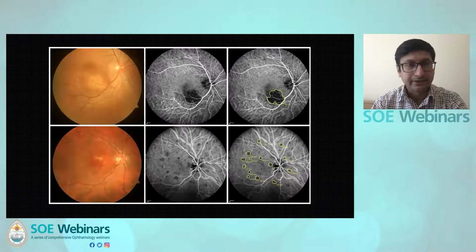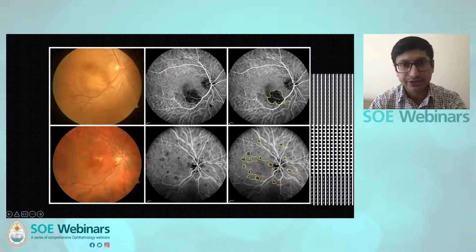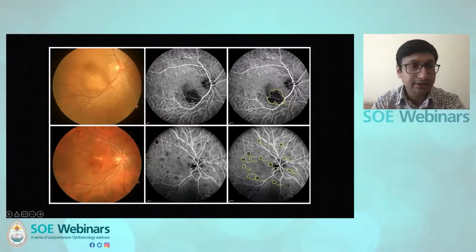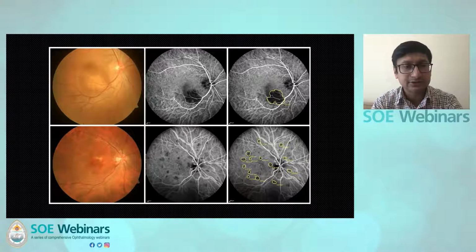Also, you see the panel above, this yellow lesion, like I showed you in a previous patient. This is another patient who has subretinal fluid, an intense yellow lesion. And this lesion is a single large lesion suggestive of TB. The patient below shows you multiple hypo areas on ICG. Now you realize here, you don't see so much clinically, but on ICG, the pathology is so much evident.